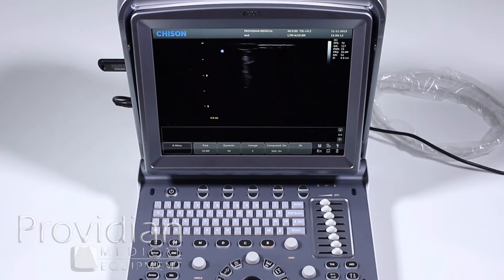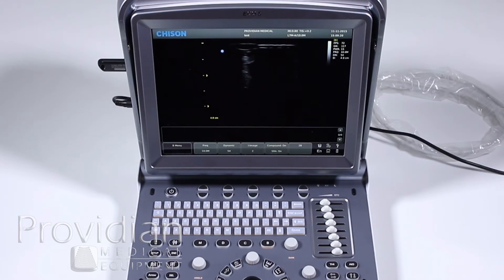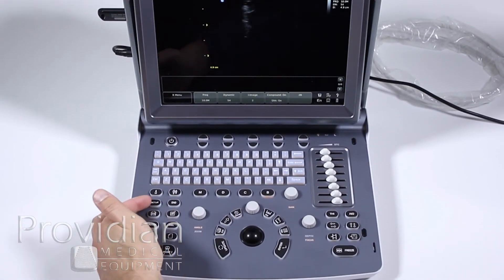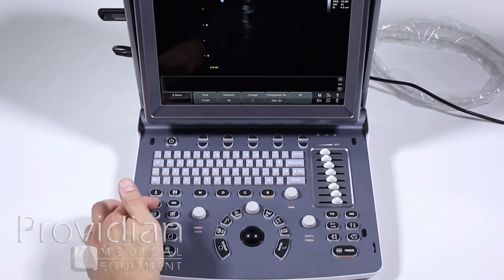You can save multiple presets depending on the exam, the body type, etc. So it just depends on how much you want to play with the machine and how much you want to customize it. So let's now get into the full system setup here and press the system setup right here.